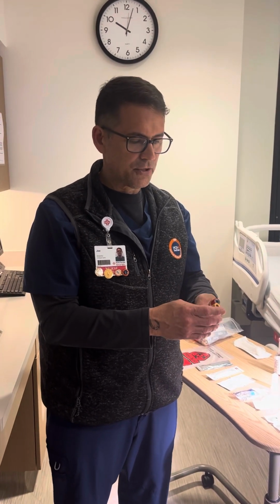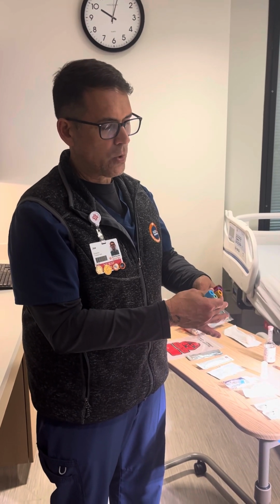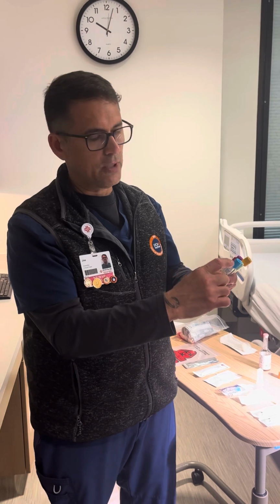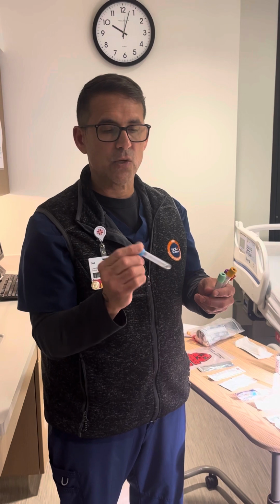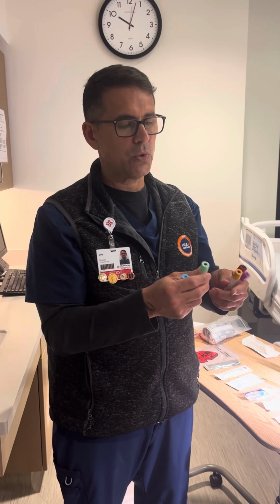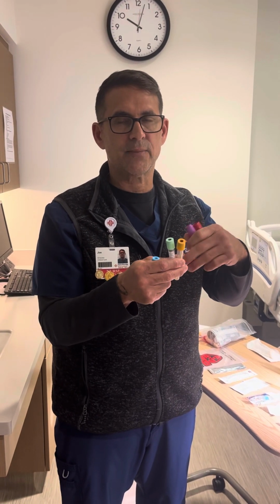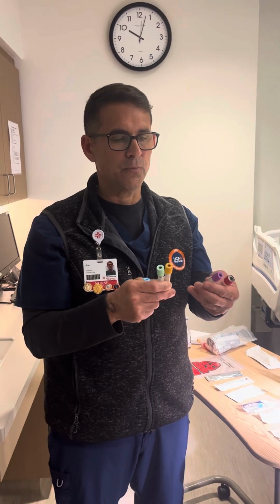So just to go over this again, let's say you're drawing a full rainbow on somebody, 10 mLs on a bigger kid, or even on smaller kids with bullets. You always want to do the blue one first. The blue one has to do a lot with clotting, so you want to get it as soon as you draw. The last one you want to do is the green or the yellow, because these have a clotting factor inside of them. If you poke these first and some of that clotting factor got in your syringe and then you put it in the blue, you might get some clotting in the blue.